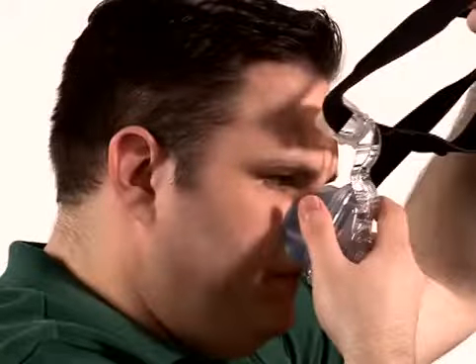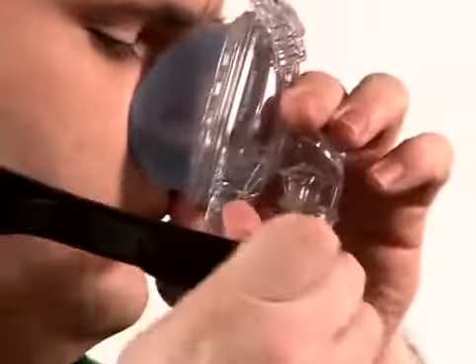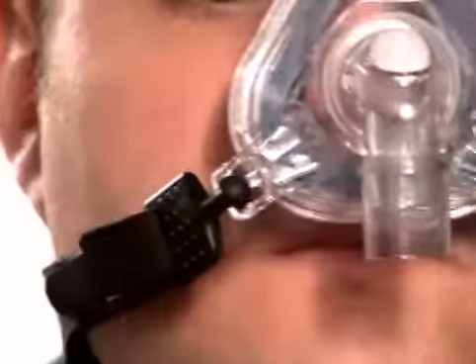To put on the mask, hold the mask cushion gently over your nose and pull the headgear over your head. Attach the quick clip on the disconnected side. Use your index finger as a guide to find the position of the socket and press the clip into the socket.